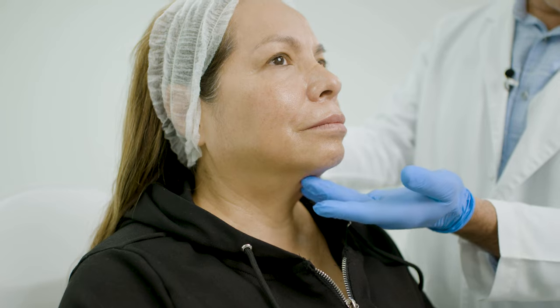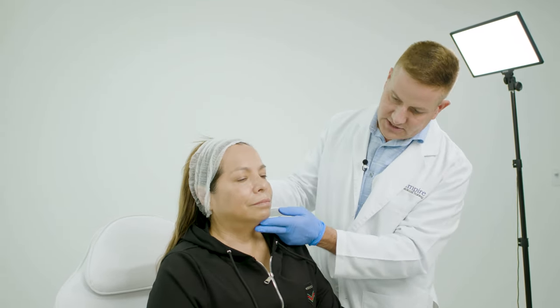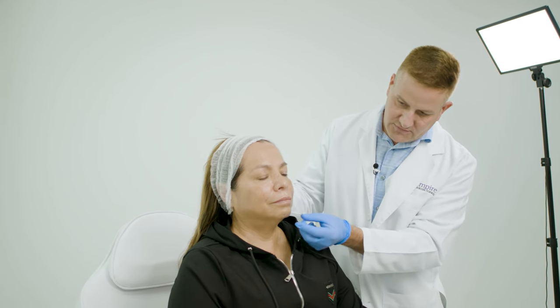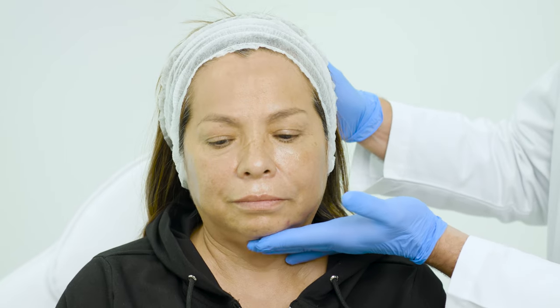One of my favorite treatments to do in this area for that particular problem is PDO threads. Today we're going to be using Alari threads, and I'll use a 29 gauge 25 millimeter monofilament. You're going to see that I place this in a pattern that forms kind of a basket weave pattern under here. As those threads dissolve and stimulate collagen, it's going to tighten this area up.